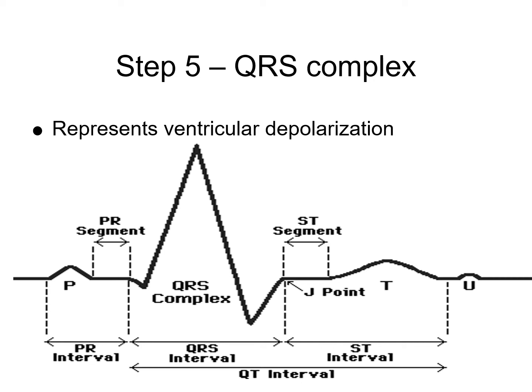So we also have to look to see if that Q wave part has that little tiny blip of a first negative deflection. If we're really analyzing each part of the QRS, the R wave then is your first positive deflection, the tallest part of the waveform. And then your S wave is your sharp negative deflection following your R.